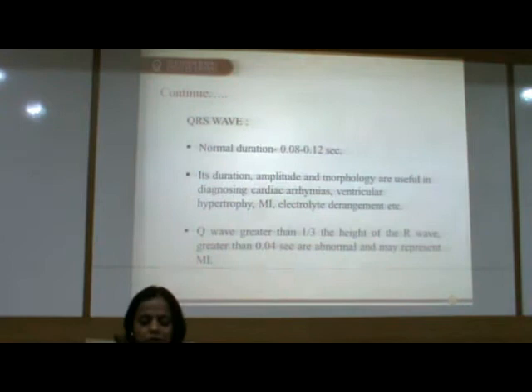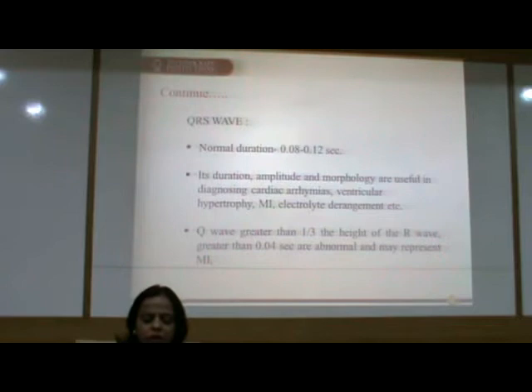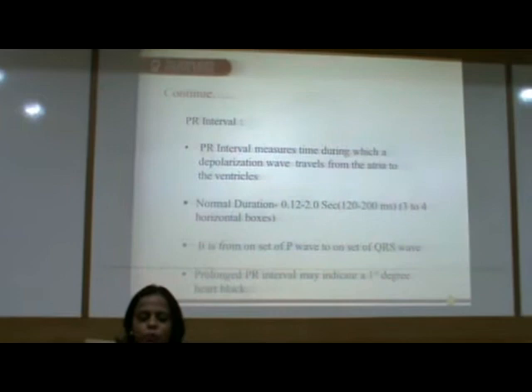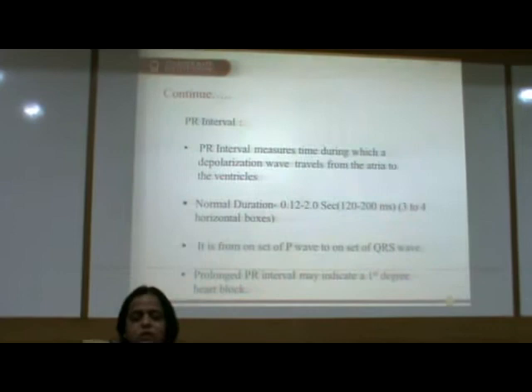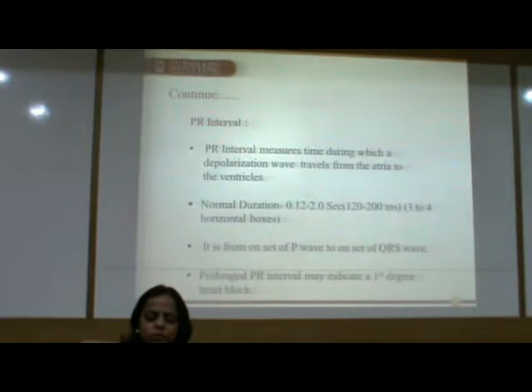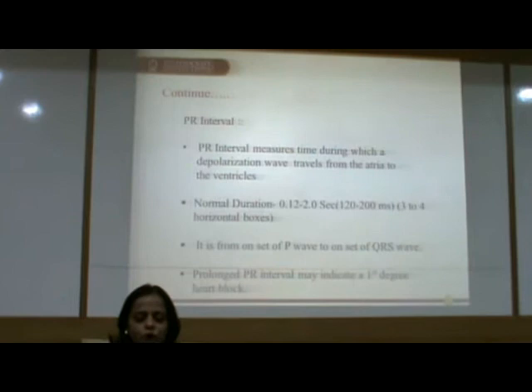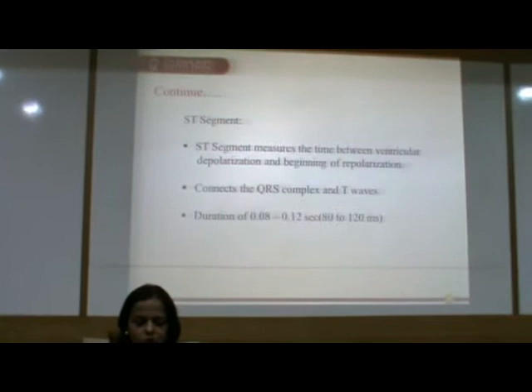A Q wave greater than one third the height of the R wave, or greater than 0.04 seconds, is abnormal and may represent MI. The PR interval shows the time during which a depolarization wave travels from the atria to the ventricles. The normal duration of the PR interval is 0.12 to 0.2 seconds, that is 120 to 200 milliseconds, or 3 to 4 horizontal boxes on the ECG graph — measured from the onset of the P wave to the onset of the QRS wave. A prolonged PR interval may indicate a first degree heart block.